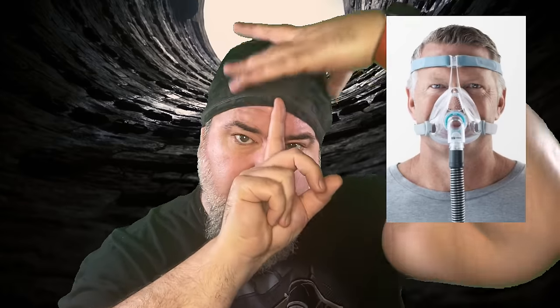Fisher & Paykel makes these really cool masks that have a stabilization bar that goes right here, and there's a strap. And what that does is keeps your mask from falling off to the side when you're using it. That's great. There are literally masks that cover your entire face. I don't know why those aren't called full face masks, but whatever, maybe they are. But typically speaking, the full face mask is either one that goes like this or like this. So terminology can be confusing.